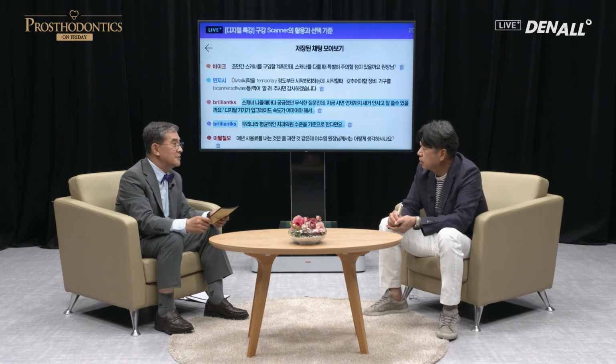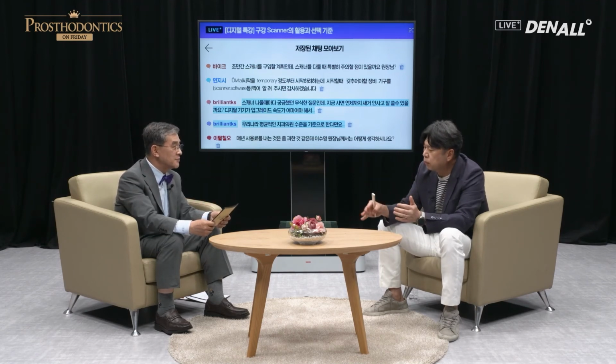But you should not choose a very cheap scanner from the beginning. I'm sure the dentist will want to use it for the final prosthesis eventually. Yes, you can buy a scanner with a certain level of performance. That would be good. In the past, we upgraded incrementally, which cost more when we upgraded our presentation slide system.